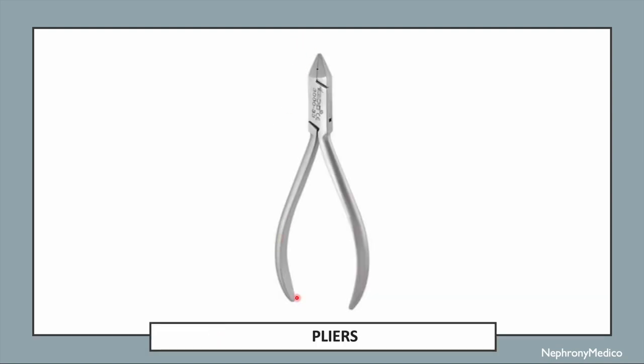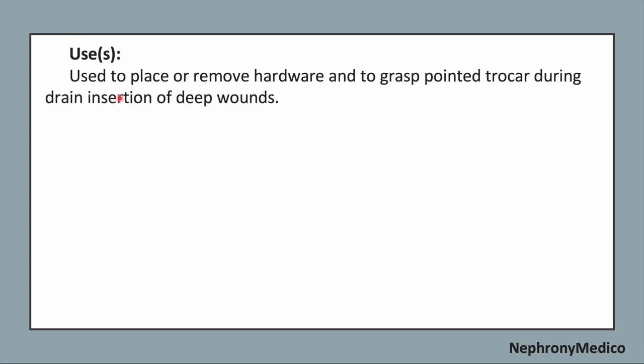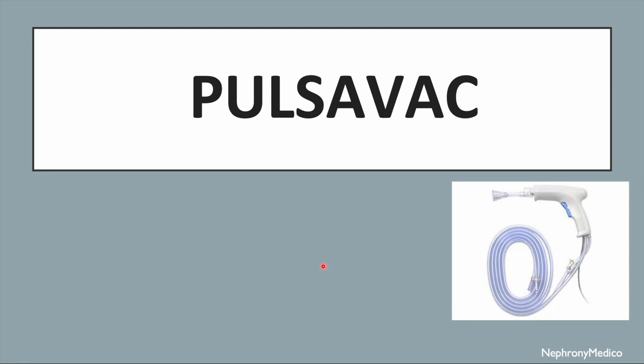Let's talk about pliers. This is a picture showing pliers. The other name of this instrument is channel locks. It is a grasping and holding type of instrument. Identifying points. The thin single action handles with thin and thick serrations and rounded end jaws. The hinge provides two opening sizes of the jaws. Use. It is used to place or remove hardware and to grasp pointed trocar during the drain insertion of deep wounds.